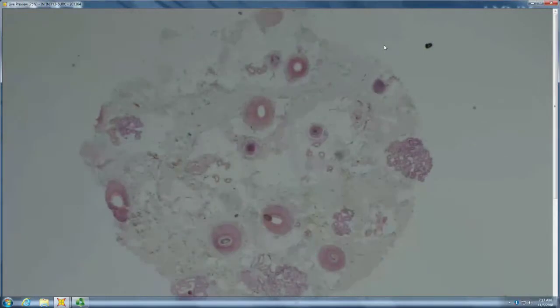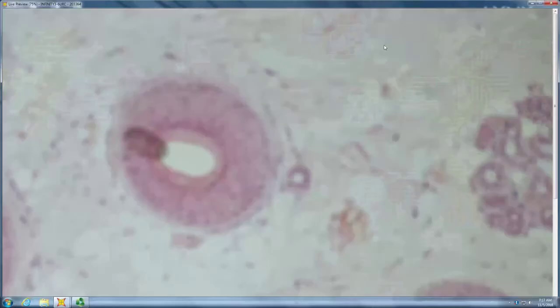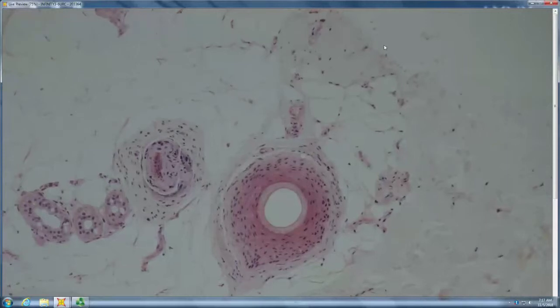And so then you want to look down towards the bulb, and what kind of things would be clues to AA in the bulb region? So eosinophils, inflammation around the bulb, so lymphs, eos. Yeah, lymphs, eos, pigment, those would be the big things.